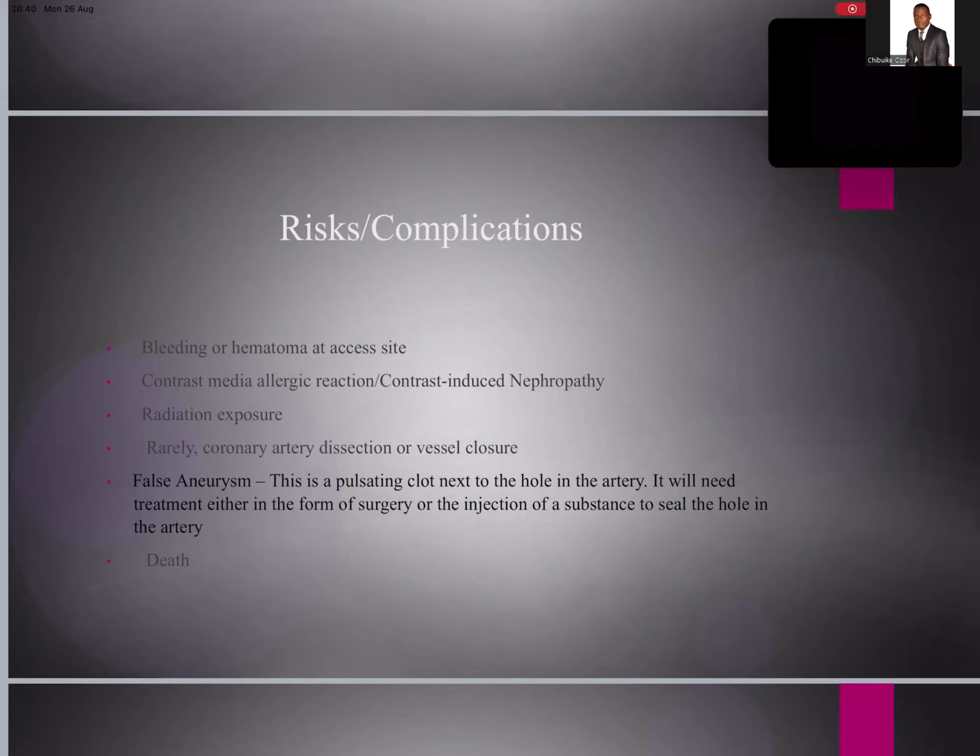However, to minimize problems related to contrast-induced reactions, of course, we have the ionic media and then the non-ionic media. The only thing is that the ionic media, which are less expensive, have a higher incidence of adverse reactions. The non-ionic media have a lesser incidence, not as if it is totally zero.